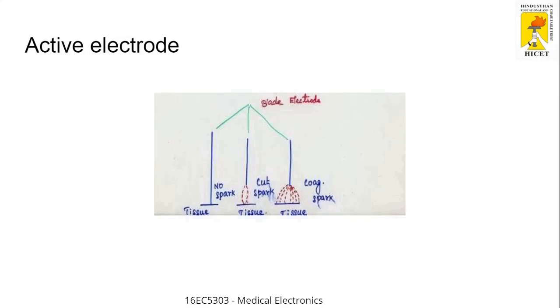During Deepavali you may be burning crackers. If you take a flower pot, the sparkling comes out like a fountain, spreading across and falling down. That is one way of visualizing your spark.